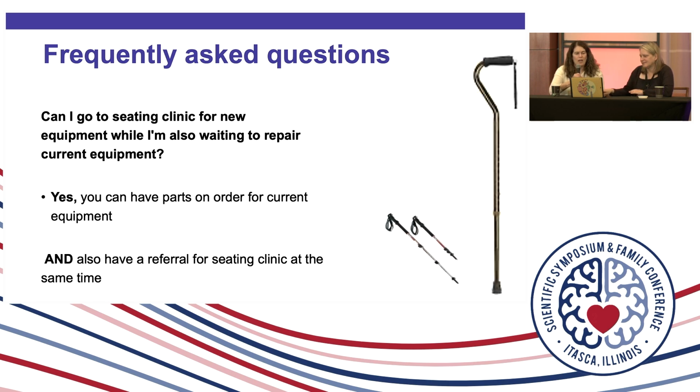Okay. Another question might be, can I go to a seating clinic for new equipment while I'm also waiting to repair current equipment? So the answer is yes. You can have parts on order for current equipment, but also have a referral for a seating clinic at the same time. So you don't necessarily have to wait or think you can only do one thing at a time.